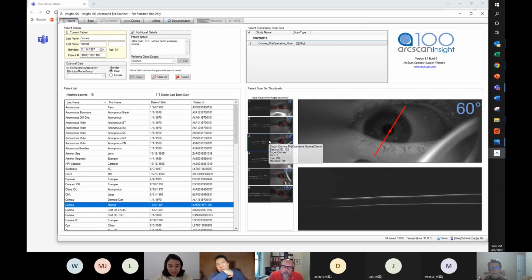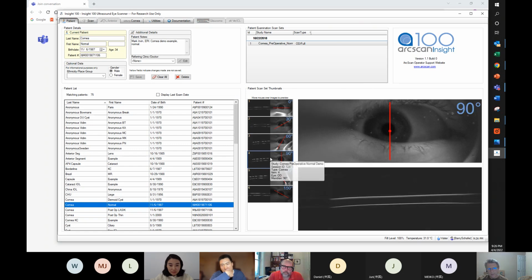Yeah. You see? Now, the patient also had their head turned in such a way that they're not looking straight ahead. They're looking kind of off to the side. And so Rick has a good idea to tape some lids. We are working on our speculum that has adhesive on it. We don't have that together just yet, but it works. I've tried it. It works very well. That'll be very useful for you. And Andy and the team are working to make that quicker.